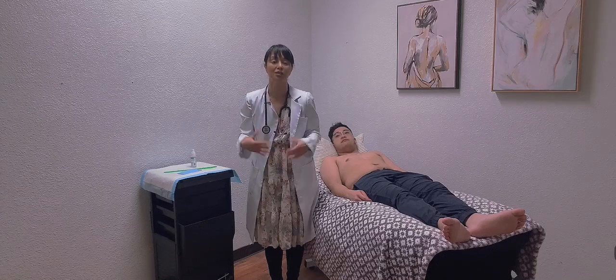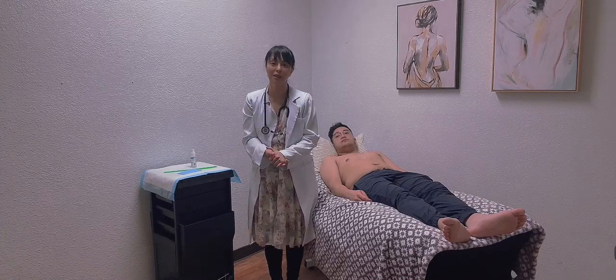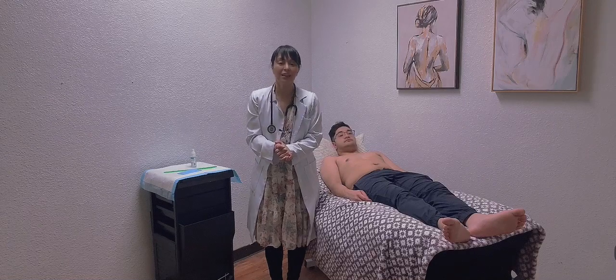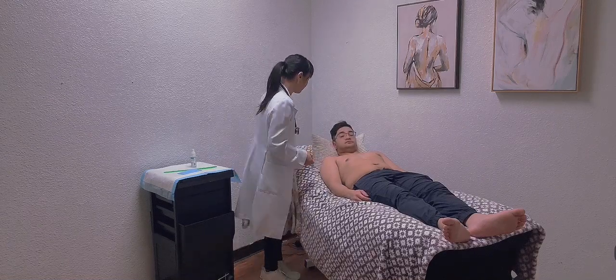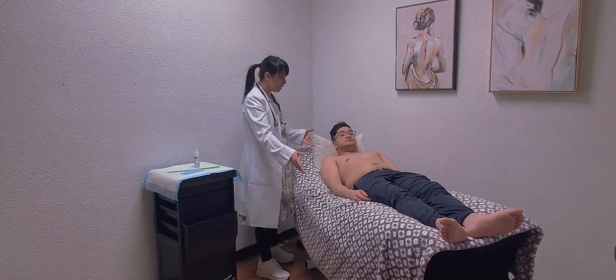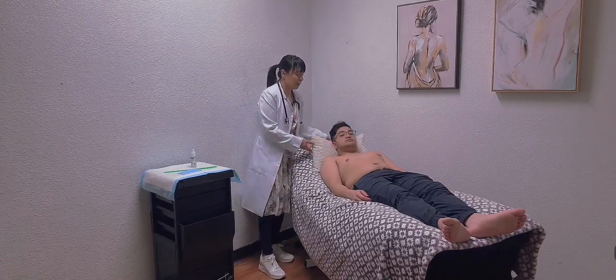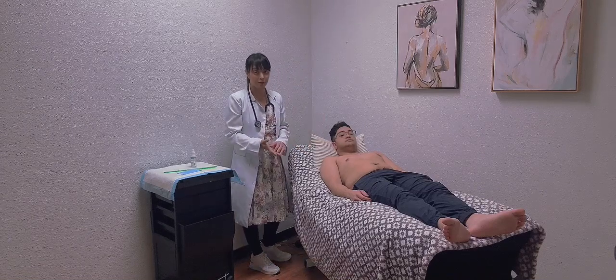I'll make sure to use the right size cuff based on his body habitus so that he can get the most accurate result. Now I'm going to position my patient supine at 30 to 45 degrees approximately, because I'm going to check for jugular vein pressure.